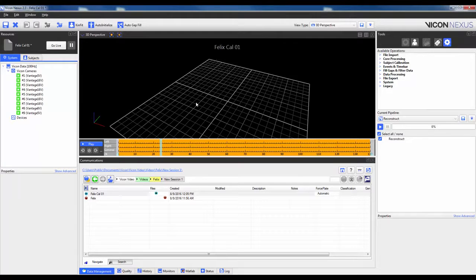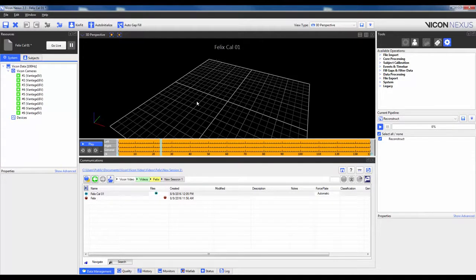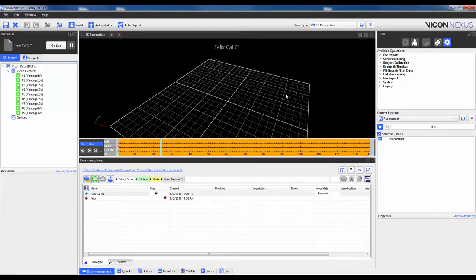With the markers reconstructed, I will then run the pipeline termed auto-initialized labeling. This pipeline calibrates the template, i.e. the VST, and creates the subject-specific VSK, or labeling skeleton.